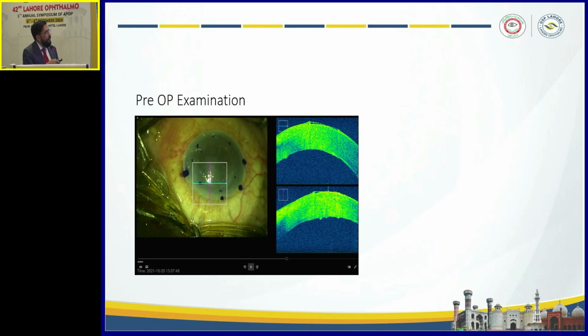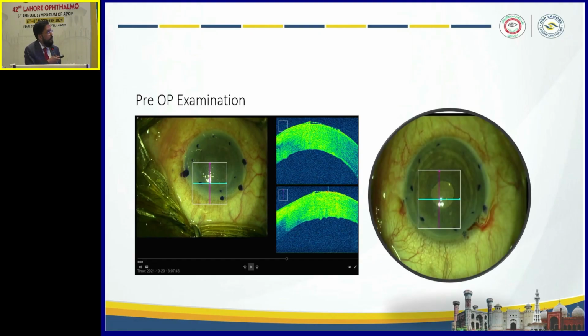So if you want to look at the OCT, you actually need to take your head away from the eyepiece and look at the screen. So again, the problem is the same, that you need to pause. So what they did was a very smart idea: they incorporated a small screen into one of the eyepieces, not both. If you click a button on the foot switch, you'll get this window. Now this superimposed image is visible to you, and this is a live OCT. But obviously there is a learning curve, because sometimes you need to suppress that superimposed image and concentrate on your real surgical view. And sometimes you take your attention away from this to the OCT view. But again, you don't need to move your head away.